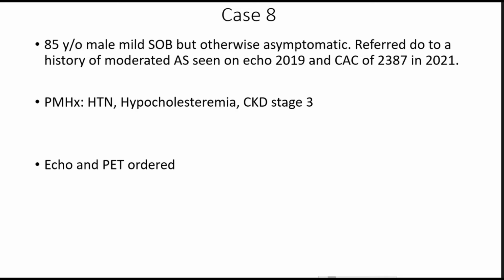Okay. I was just curious if we were missing something or if there was some technique that should be used by echo for those circumstances, which it doesn't seem like there necessarily is. Okay, great. Well, let's go on to another case.